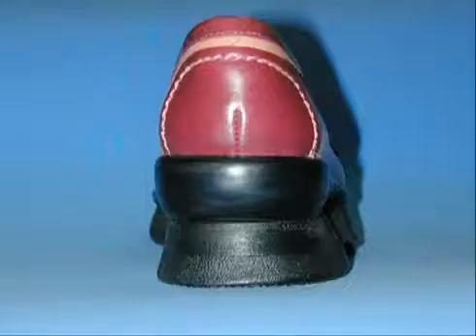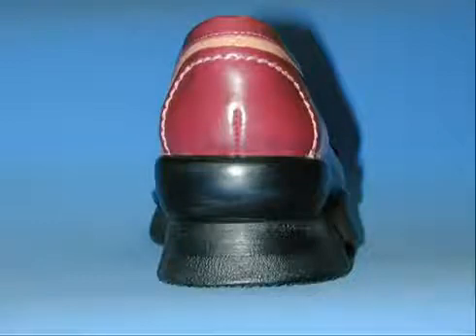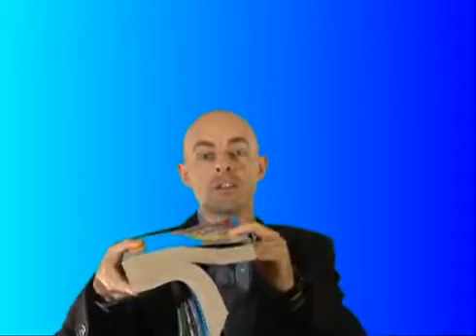Regardless of the measurement made, I like to go low-tech and test what feels comfortable for the patient. It is possible to do this using cork blocks — have the patient stand on them and place the blocks under the heel until they feel most comfortable. Even in this high-tech age, you can use the phone directory and place various thicknesses of sheets underneath their heel until they find a comfortable position. You can then measure the thickness of the phone book, and that will tell you approximately what your first lift should be.